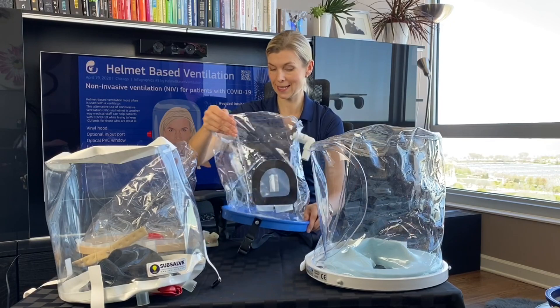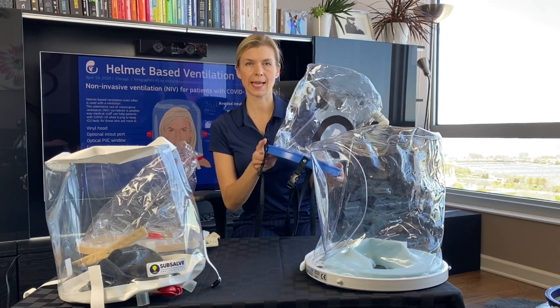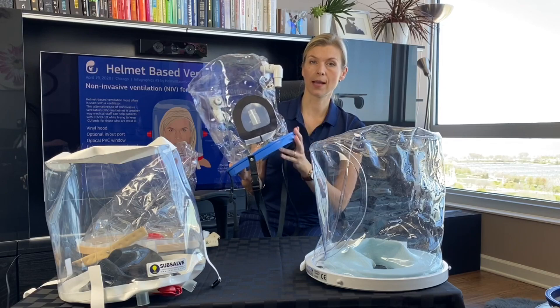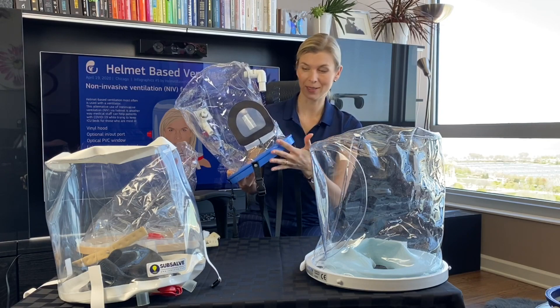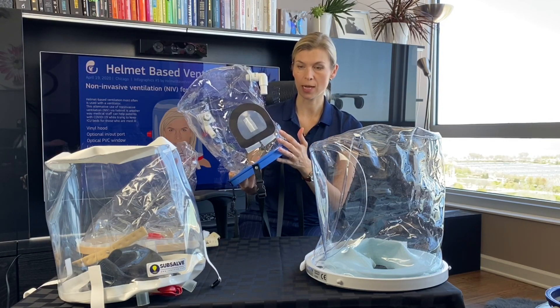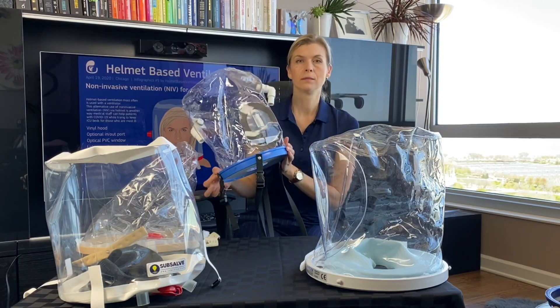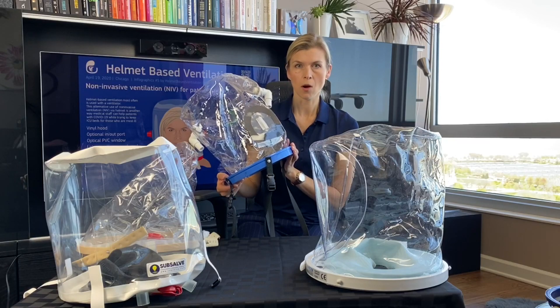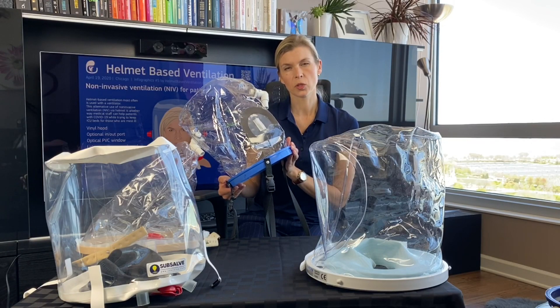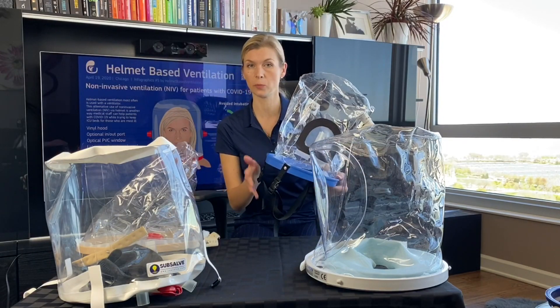These two helmets here are a prototype from Virgin Galactic, NASA, and The Spaceship Company. Design changes are happening as we speak, so this is not the final product. I gave a review in my previous video about it so you can learn more there. A great team with great experts and minds are behind this project, and they are also working on other solutions to fight the pandemic of COVID-19. I'm going to put this helmet aside for now since it's not the final product yet.